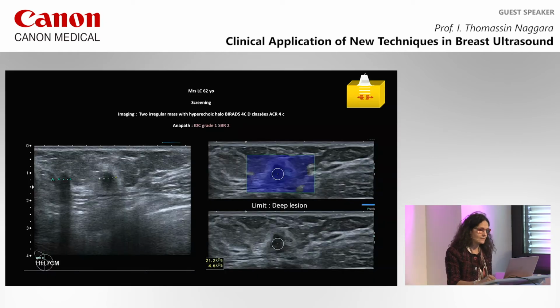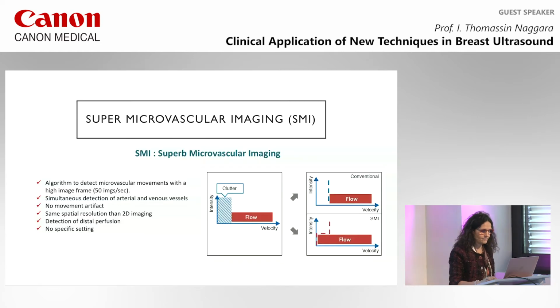And here, in this example, no problem on B-mode. This lesion is a hypoechoic lesion with halo, so the classification using the B-mode is typically suspicious. But when you apply the elastography, you can see that the coefficient is quite low, and probably it's because it's a very deep lesion, and we know that there are some false negatives in this type of lesion.